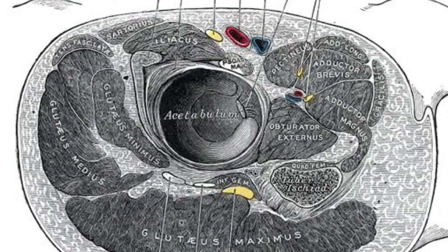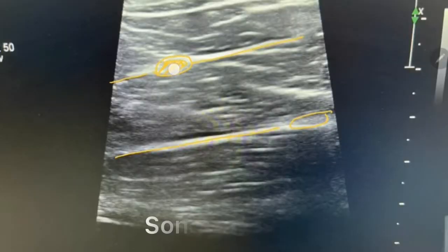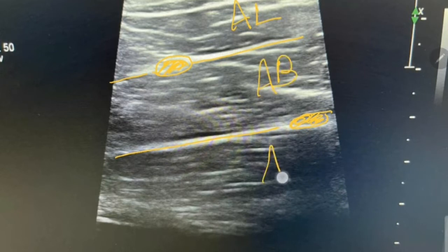The best place to block the obturator nerve using ultrasound is where it divides into anterior and posterior branches. The anterior branch can be found using ultrasound between the adductor longus and adductor brevis muscles. The posterior branch lies between the adductor brevis and adductor magnus muscle.